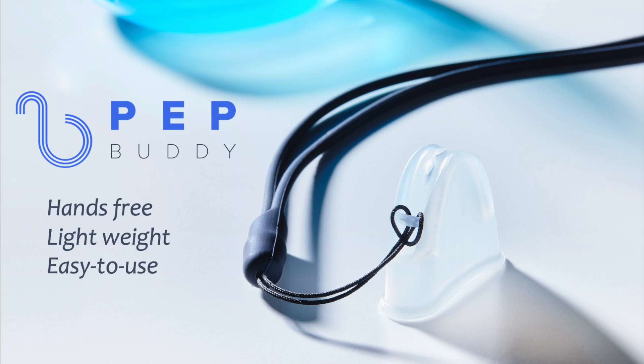Hi, in this video we're going to learn how to use PepBuddy for your COPD and also for mindfulness and anxiety reduction. PepBuddy comes in a small case and this case can be used in your purse, in your pocket or wherever you want to keep PepBuddy safe. You will take the device out and it is designed to be hands-free and lightweight so you can hang it around your neck all day long and use it whenever you need it.